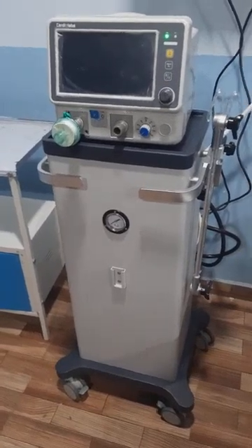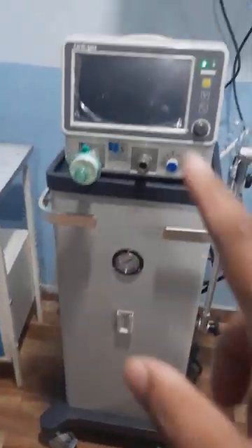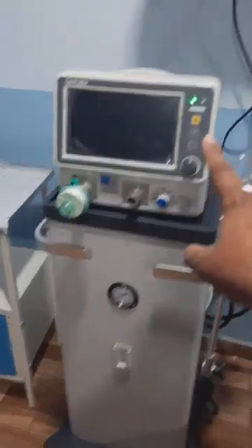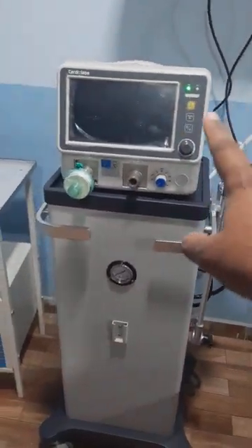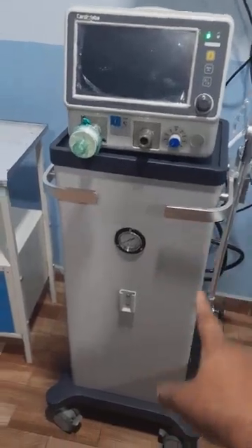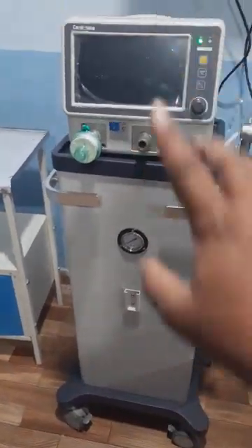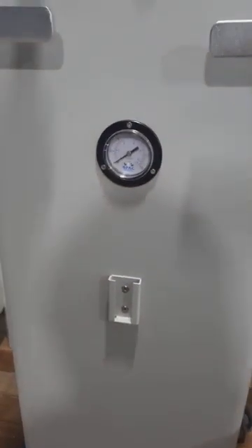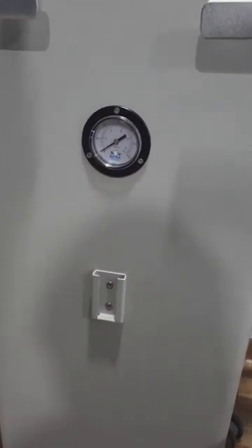I will go ahead and show you how the ventilator works and what the different modes are. The upper piece is the display monitor — it will show you all the values. The lower stand on which the monitor rests is the compressor, and as you can see there is a graduated pressure gauge here.